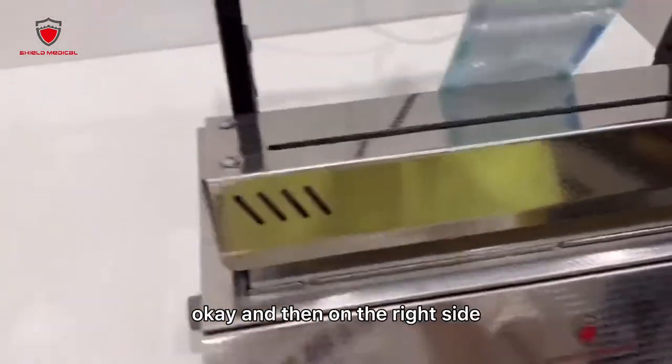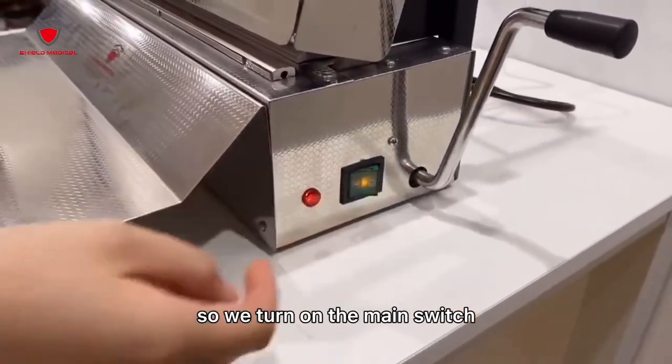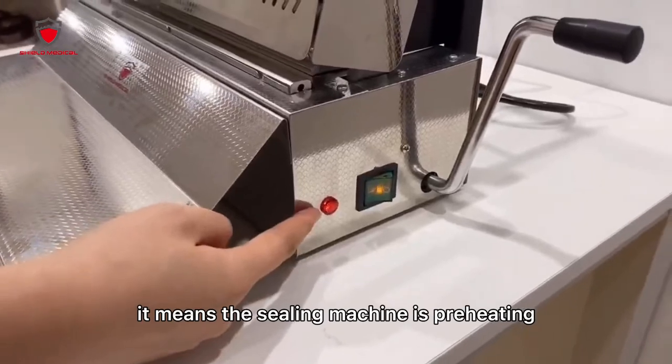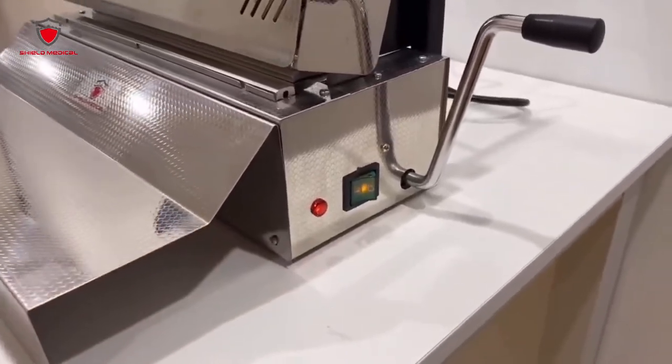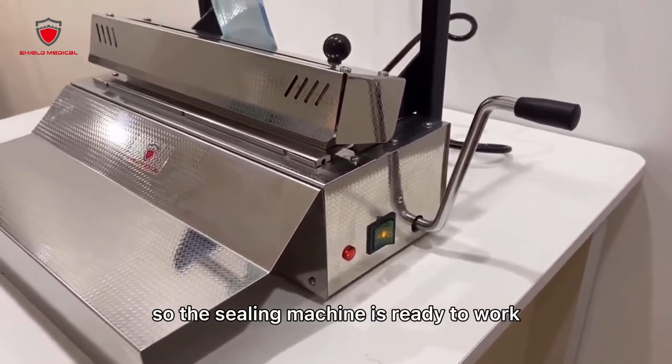On the right side there's a main switch. Turn on the main switch — the light is on, which means the sealing machine is preheating. You need to wait until the light is off, so the sealing machine is ready to work.